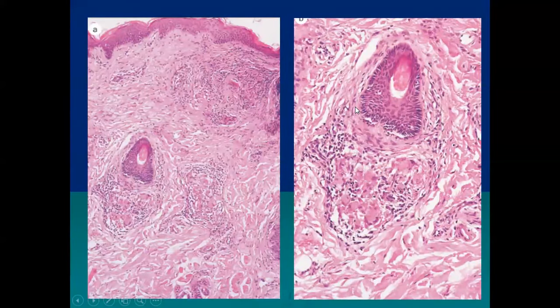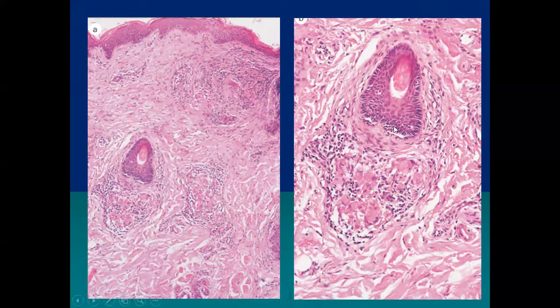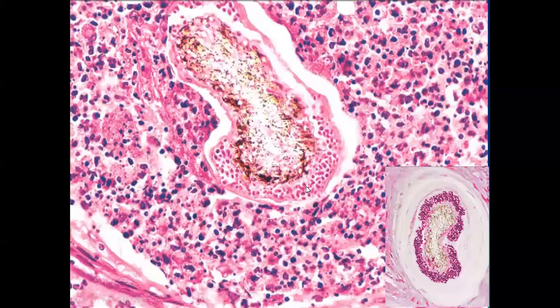These two images show granulomas surrounding the hair follicles. When granulomas are seen around hair follicles, the differential diagnoses are granulomatous rosacea, lichen scrofulosorum, and Majocchi's granuloma. In Majocchi's granuloma, the granulomas surround the hair follicles and fungal spores are visible within the hair follicles, highlighted by PAS stain.